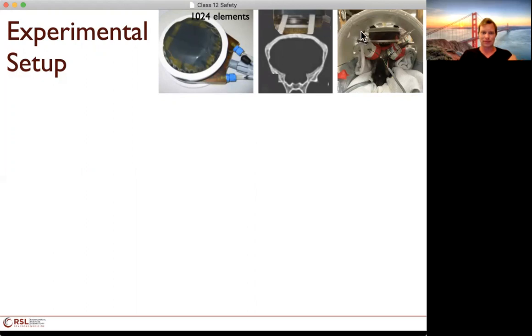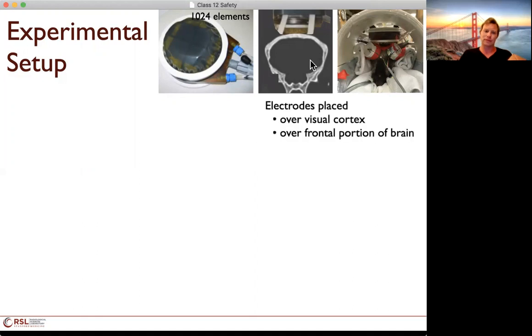So what we did was we attached that transducer to the top of the MRI head coil. Then we placed the sheep underneath the transducer and snug up against that membrane so that he would be well coupled. You can see the flashing lights on his eyes. As the sheep was up against the membrane, they had a nice flat homogeneous part of the skull, as you can see here, this is the CT. And we did have the electrodes placed on his head.